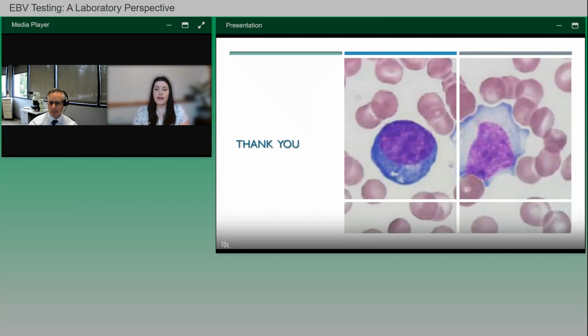So this last question we're going to ask today says, is Monospot totally out of the question to use? No, I mean, as I showed, there are algorithms that still use it. I have a friend who's a physician assistant in a rural part of Oregon, and he uses it all the time because that's what they have on site. As I said, it can help him rule out mono, and then he goes down his other differential diagnosis for the symptoms. So it is still used, but if you have the panel available, then in that context, yes, it's obsolete.